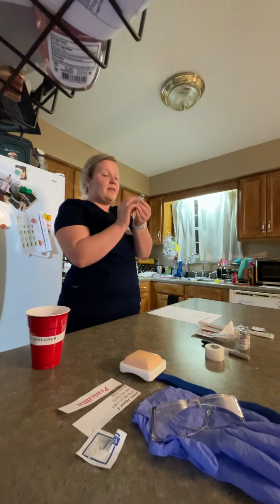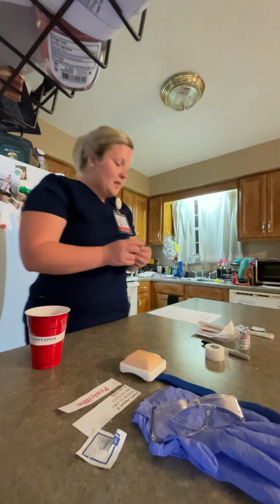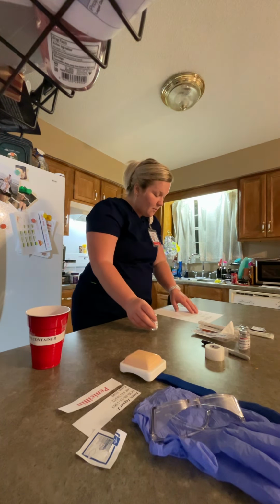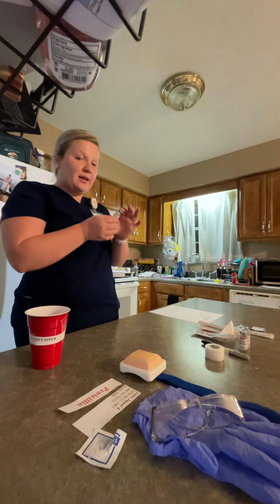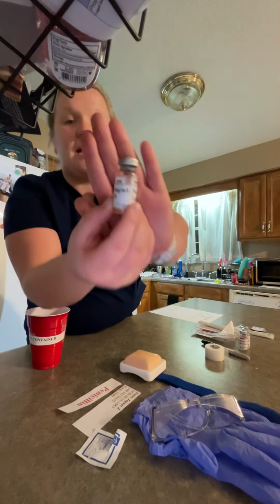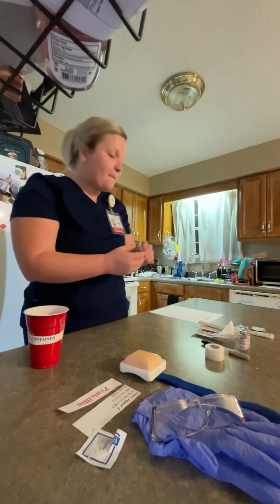I'm also checking the expiration date. The expiration date for this is 12/20/2025, so it is good. I need 5 milligrams. This is a 10 milligram per milliliter bottle, which means I need 0.5 milliliters.